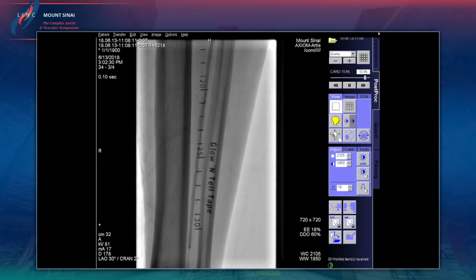So BK, this vessel doesn't seem that calcified. We had in the former live case from Leipzig this bullfrog technique. What do you think about that? With the Mercator technology, we've discussed it actually in Journal Club, and we've talked about that particular balloon. It's very interesting to me because obviously inflammation plays a huge role in that, and I think it's very interesting to see how it pans out.